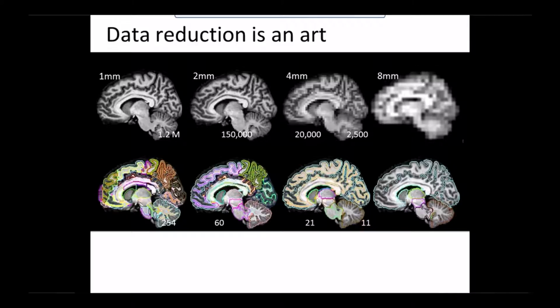If you look at the bottom row, we would have gone down to 21 structures representing the brain, and they would be structures like right side, left side, cerebellum, pons. Those are global names, and the representation would be associated with their contrast, so you'd have a single number for each of those substructures. If you look to the second column, we might go down to 60 structures, so we would subdivide the left and right into different lobes. You can see different colors there that represent different lobes.